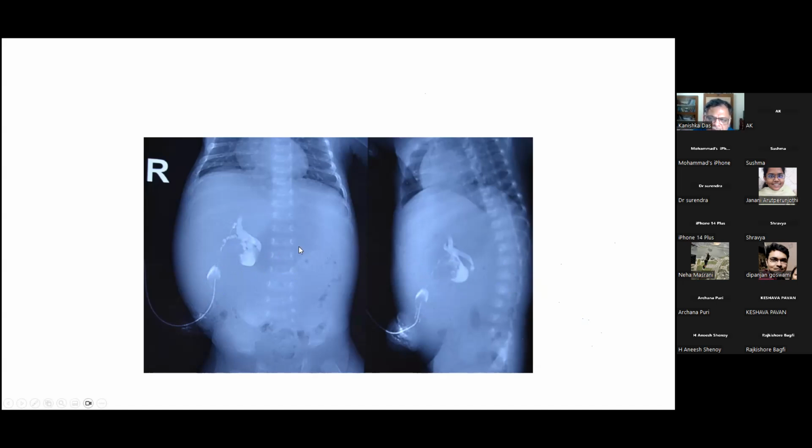Yes, sir. Is there any other thing that you want to check? Because you said that this is dilated. Any bile plugs distally, sir? But bile plugs distally, isn't there any other way of making that out? In your contrast study, how else can you make out whether there are plugs and whether there are obstructions? In a given patient, you are thinking of an obstructive cholangiopathy in this child. How do you make that out?